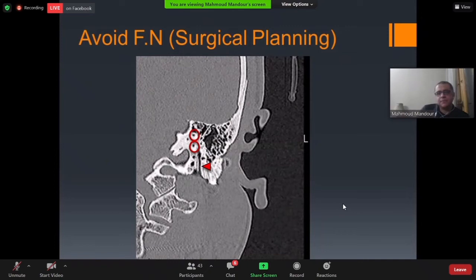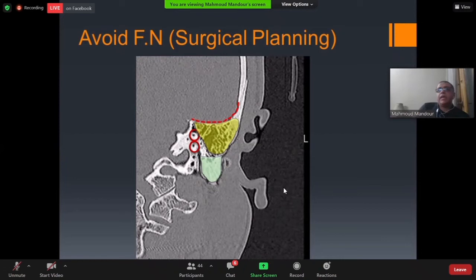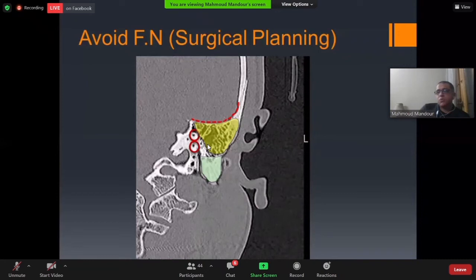An important finding to note is that if the mastoid bone over the facial nerve is sclerosed or hypopneumatized, this actually protects the facial nerve during mastoidectomy. Excessive aeration extending to the mastoid table means one air cell leads to another and you may find yourself suddenly on the facial nerve. A sclerosed region will stop your drilling, providing a natural safety barrier.